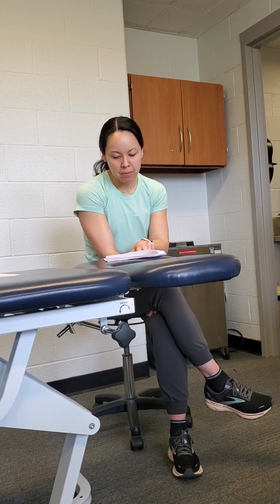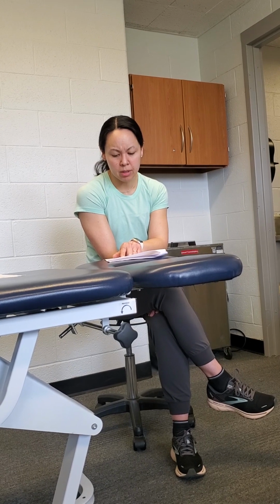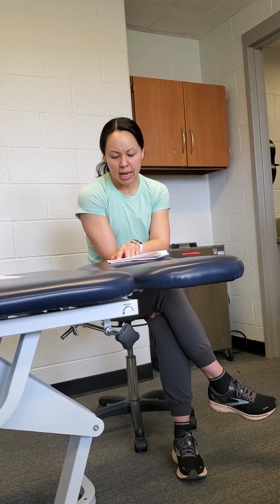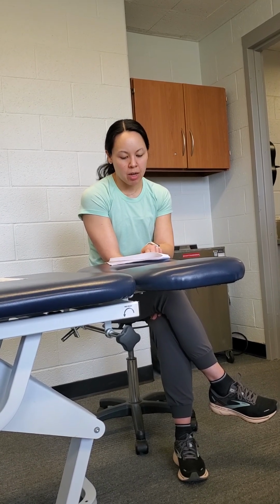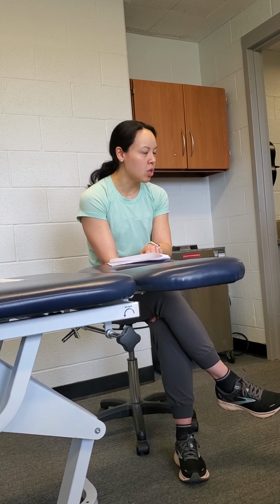There was a pilot randomized controlled study on anterior knee, like patellar tendon pain, back in 2018. The study had them do long arc quads at 80% of their limb occlusion pressure with a pain rating of 4 out of 10. So 4 out of 10 or lower was okay.